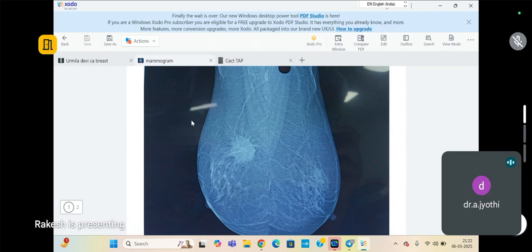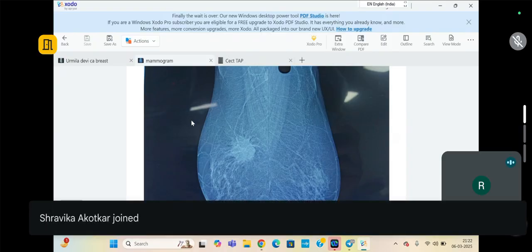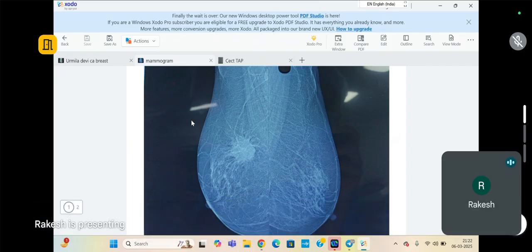So what all are the things that you look for in ultrasound of the breast? So ultrasound of the breast, first of all, it will tell us about the exact size, location, taller than wider, vascularity. So describe. Suppose it's a lump, that one lump which is seen on mammogram only. So describe it on ultrasound.